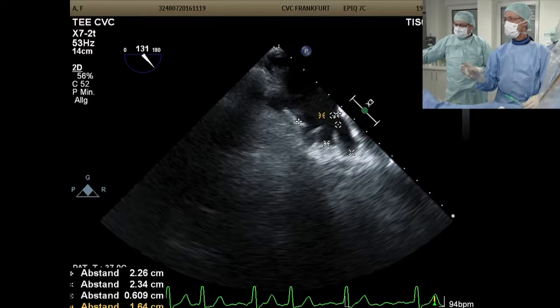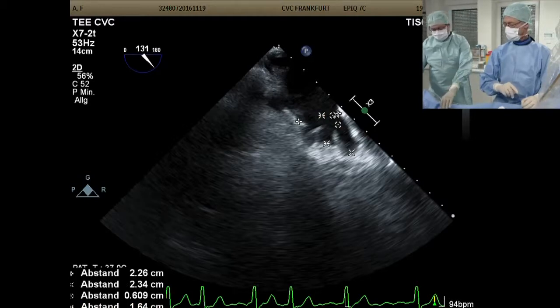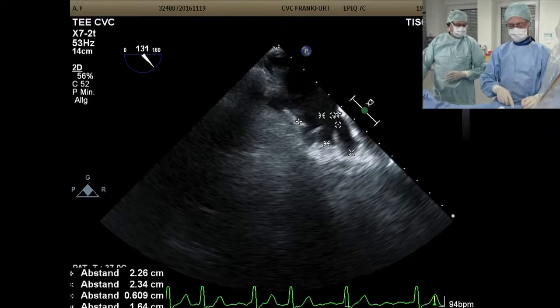Now, Peter, look at this. This is the landing zone into the middle lobe, and it's 16. Okay, Matt, I think it's probably feasible with the Watchman. The lack of clarity is how rigid the septae are between those lobes. So you could get a device with adequate depth in the anterior lobe, but the feet may never expand.